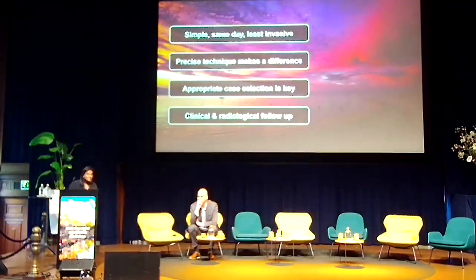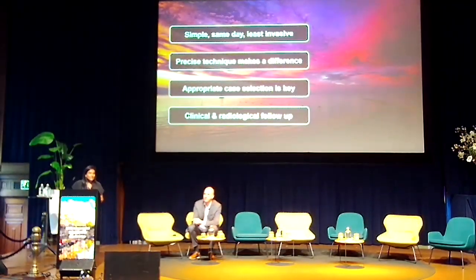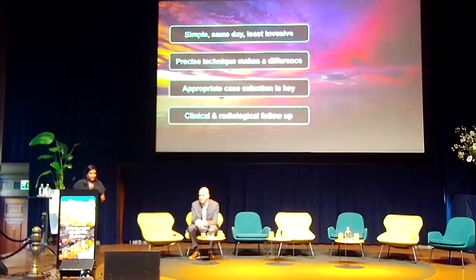So I think fibrin can be a simple same-day technique, and it's probably the least invasive. There are risks to warn your patient about, and precise technique does make a difference. And there are appropriate case selections based on the different types of leak, but you still have to clinically and radiologically follow up your patients.